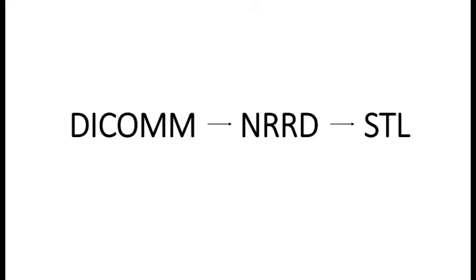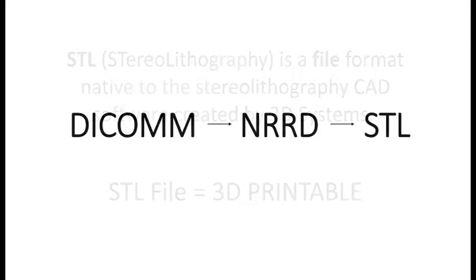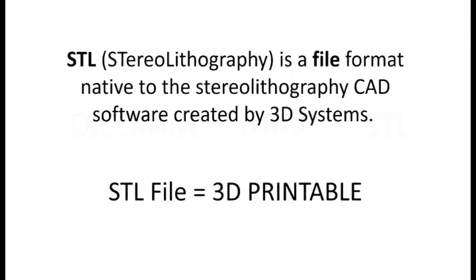Today we're going to talk about taking DICOM data from a CBCT and converting it into a file that is printable with a 3D printer. That file needs to be an STL file.